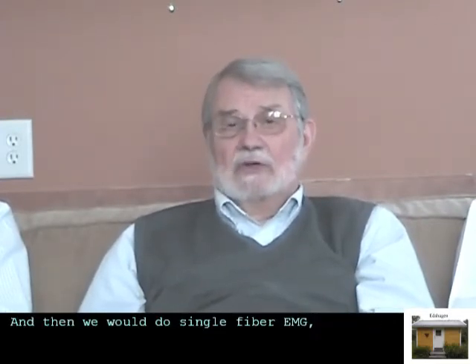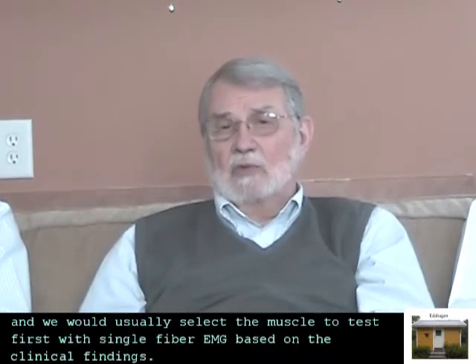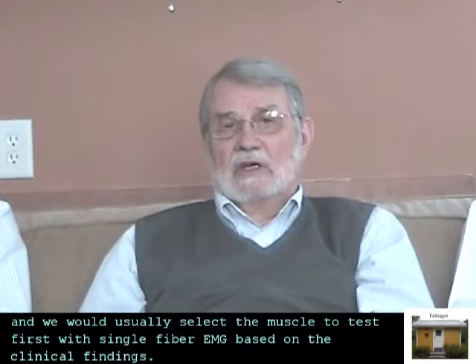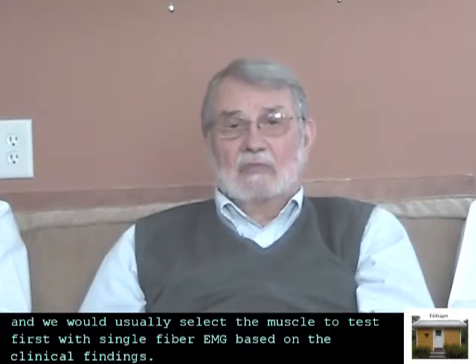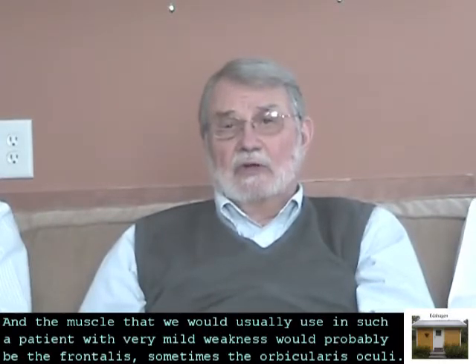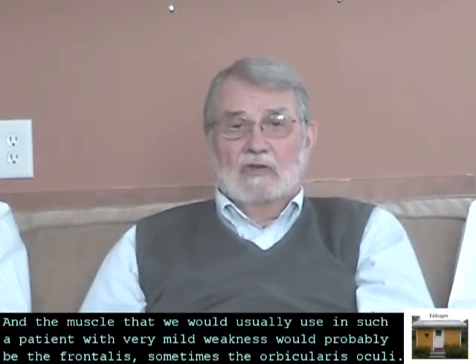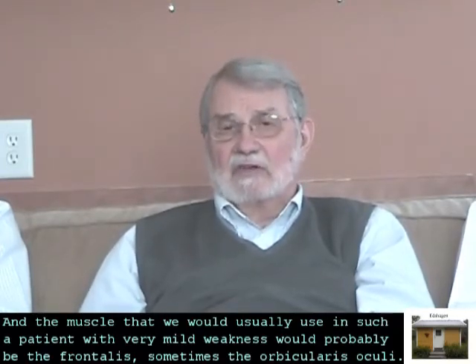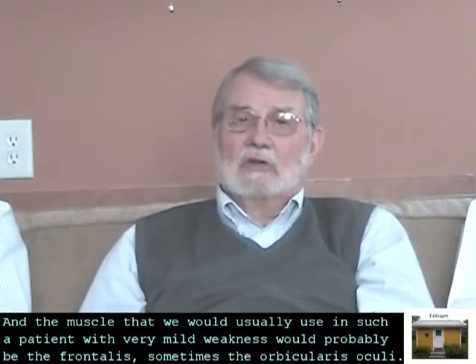And then we would do single fiber EMG, and we would usually select the muscle to test first based on the clinical findings. The muscle that we would usually use in such a patient with very mild weakness would probably be the frontalis, sometimes the orbicularis oculi.